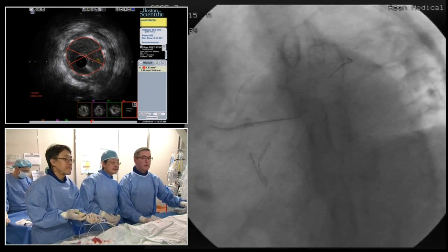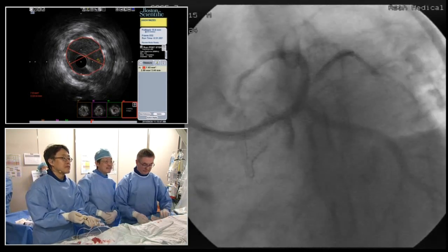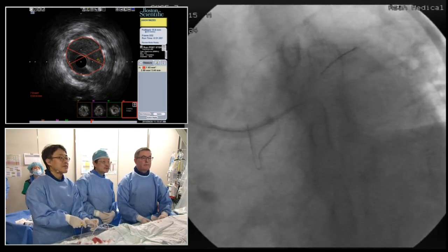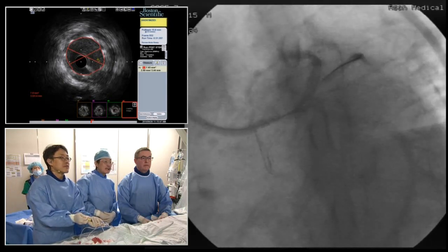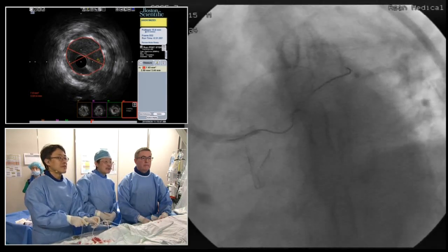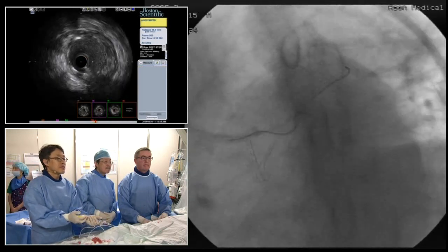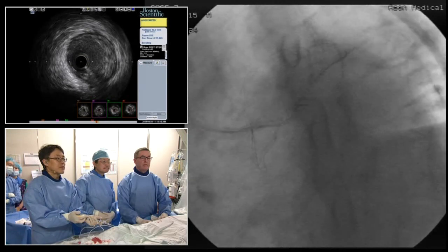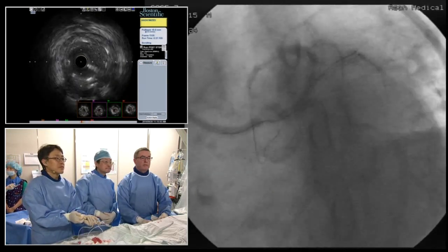Any experience of that? Yeah, we do have a double lumen microcatheter. It's a fairly large profile, and to be perfectly honest, it doesn't help under most circumstances. I think there are some better versions of this, both in Japan and in Europe. Sometimes it positions you across from the origin, so I'm not sure that would be that helpful.